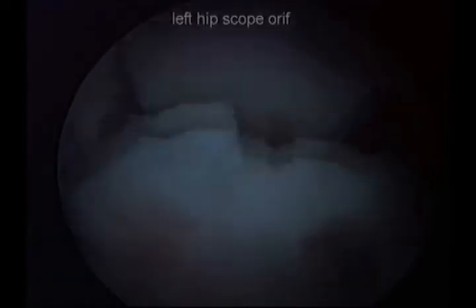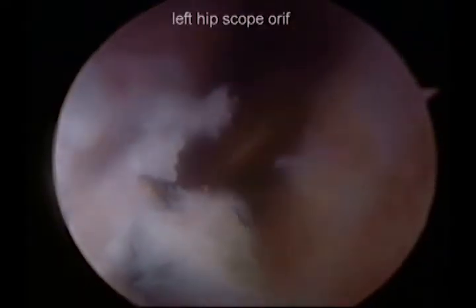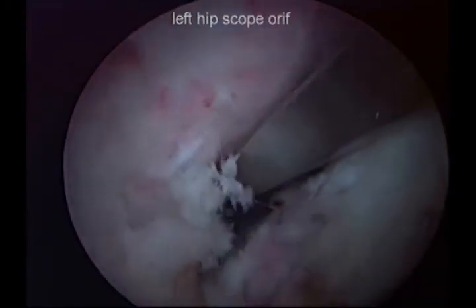Once we located this malunion site, we then used the osteotome to take this down completely so that we could free up the malunited medial fragment.